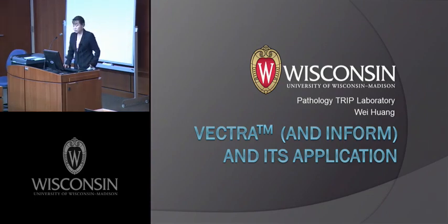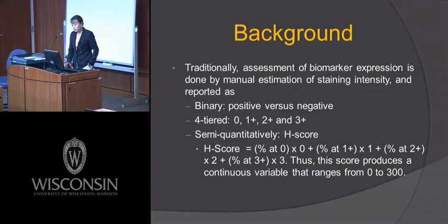Christina has introduced to you the NUANCE system. Actually, the NUANCE system is part of the Vectra system. Before I go on to talk about Vectra, I'm going to talk a little bit about the background. As we know, traditionally, the assessment of biomarker expression is done by manual estimation of staining intensity, and commonly reported as either binary or four-tiered, or sometimes semi-quantitatively with an H score.